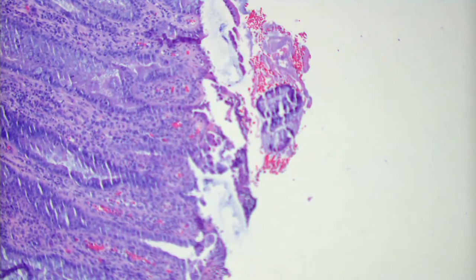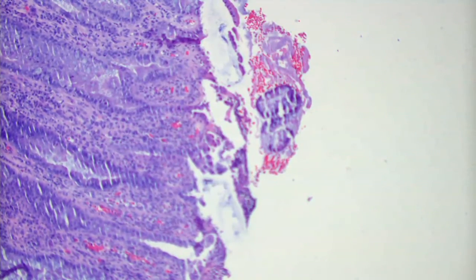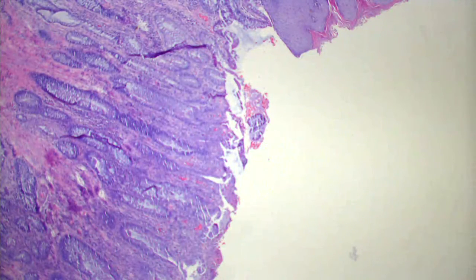So omphalomesenteric duct cyst. It's kind of a funny name because it's not really a cyst. I kind of like the polyp idea a little bit better. It's not truly a cyst, but if you were to track this back, it goes into the GI tract in many cases. So you want to make sure before you cut this out, you don't just open up something that goes straight back into their GI tract and create a fistula or something like that. This is a beautiful example of this, though.